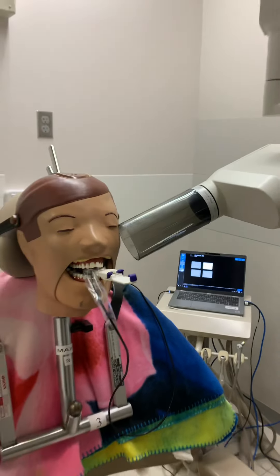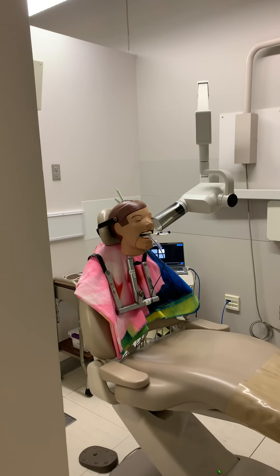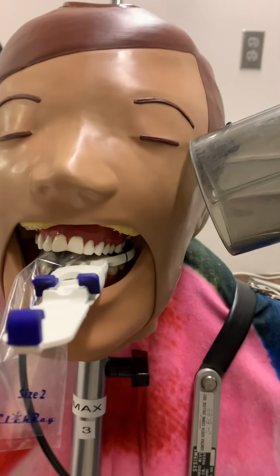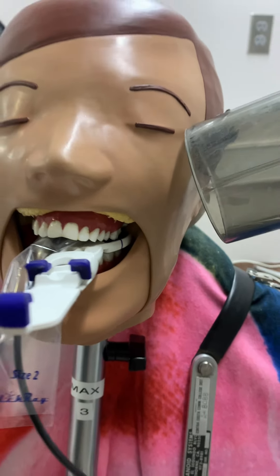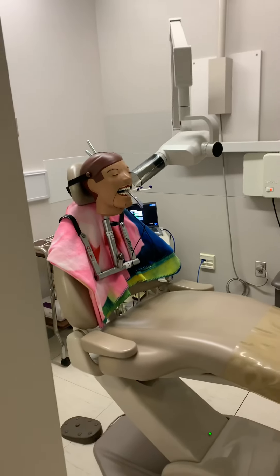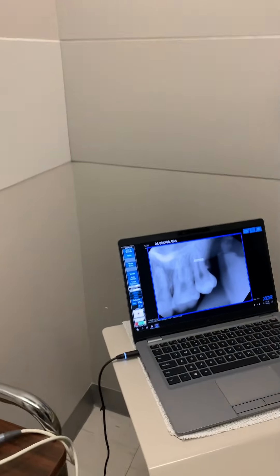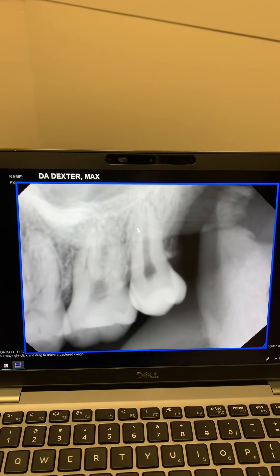Let's go hit the button. I'm going to take my x-ray. And there I've got my tooth number 16 right in my exposure.